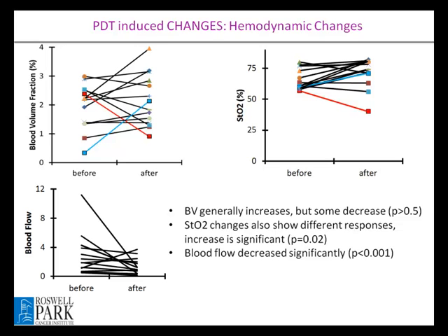So we measured before the treatment is done. The MD looks at us, and then we put the probe and do the measurement. It takes about a couple of minutes, maybe just.